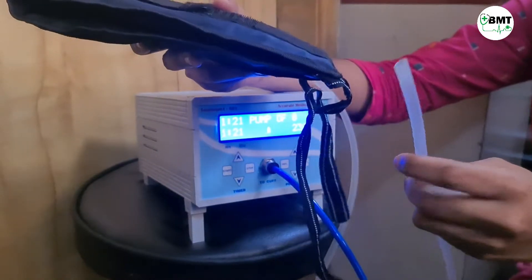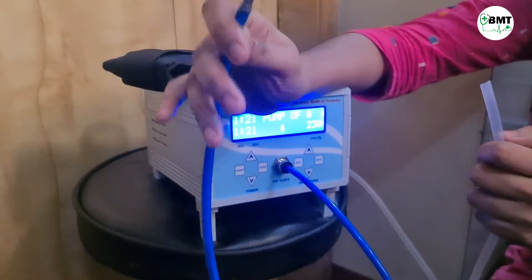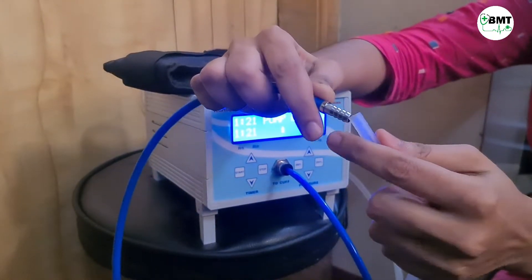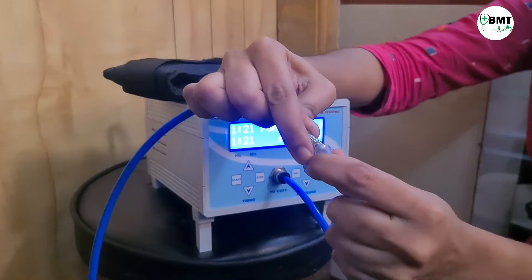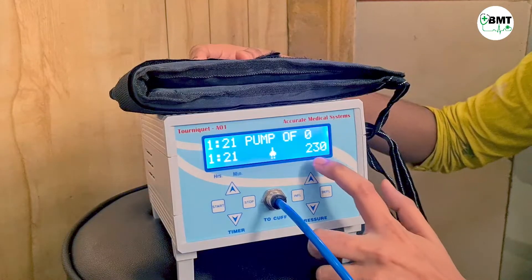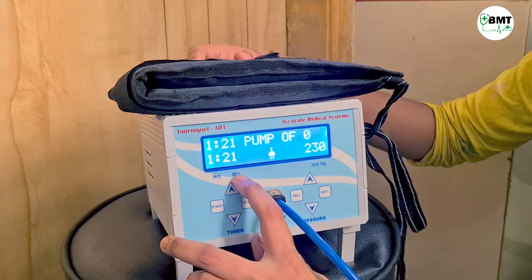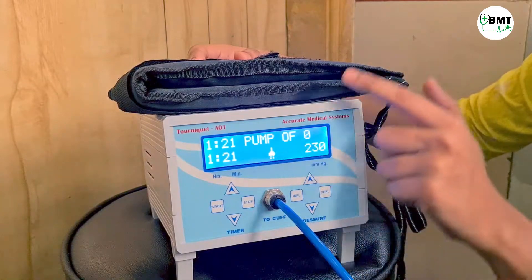This is the cuff and this is the cable which is connected to the cuff. Now connecting this blue cable with the cuff — insert it and it is connected. Here I have set 230 mmHg pressure with a timer of 1 hour 21 minutes.